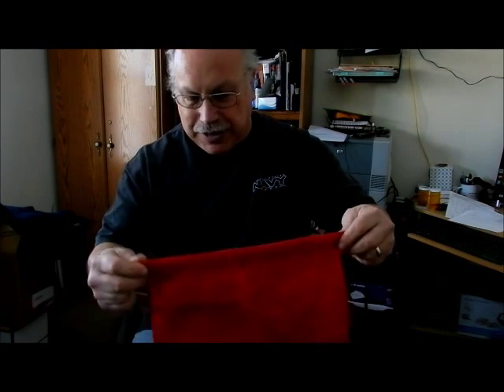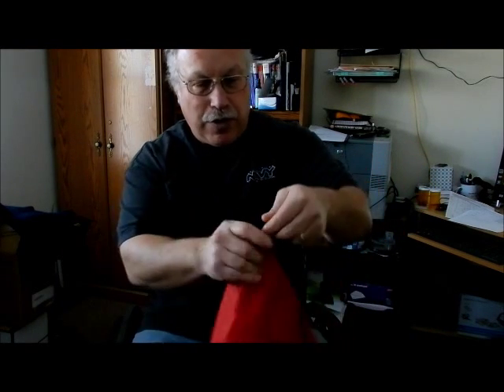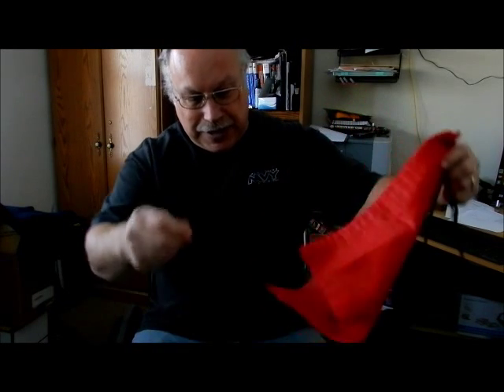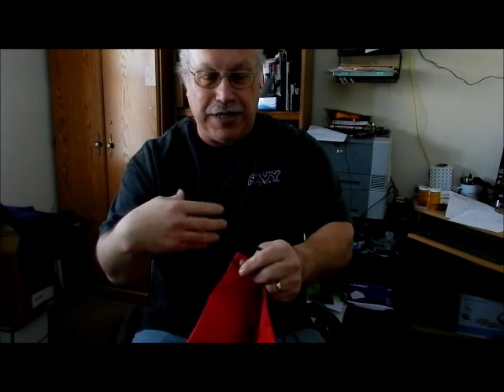Now I did take one of the strings out. There's two strings. Both of them are the same length. And what you want to do is untie these. They're just very loosely tied in. And you just untie them from both ends. Don't cut these, alright? Just untie them, get all the strings out.